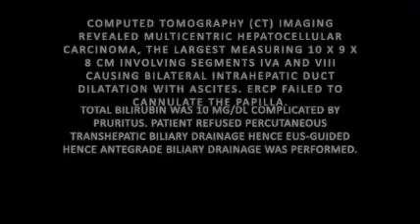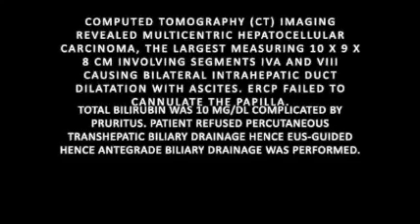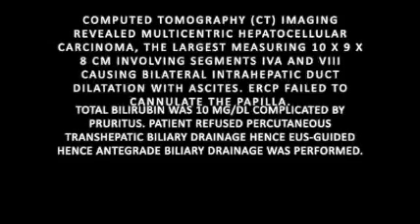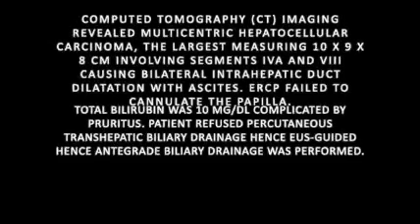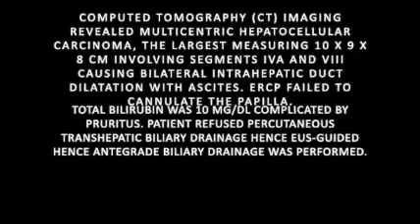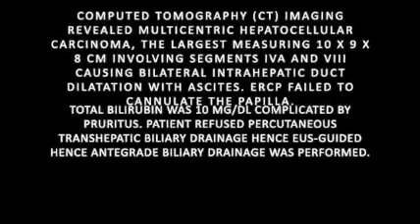A CT scan showed a multicentric HCC, largest measuring 10 by 9 by 8 centimeters, involving segments 4A and 8, causing bilateral IHD dilatation with ascites. ERCP had failed to cannulate the papilla, and the total bilirubin was 10 milligrams per deciliter, complicated by pruritus.